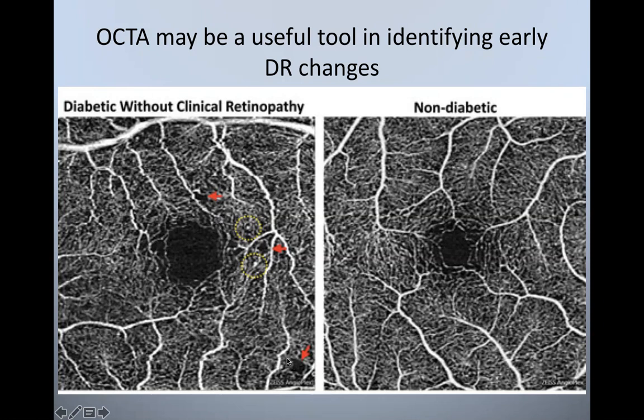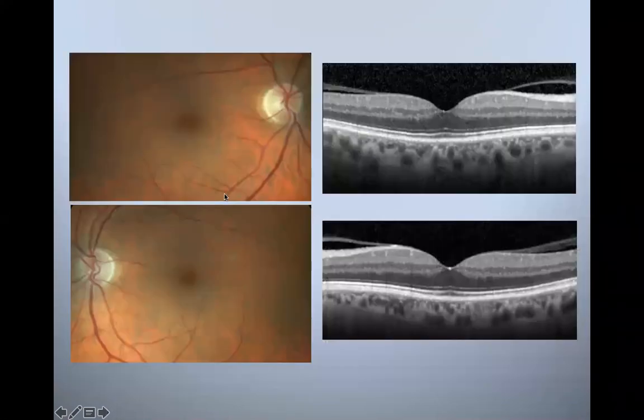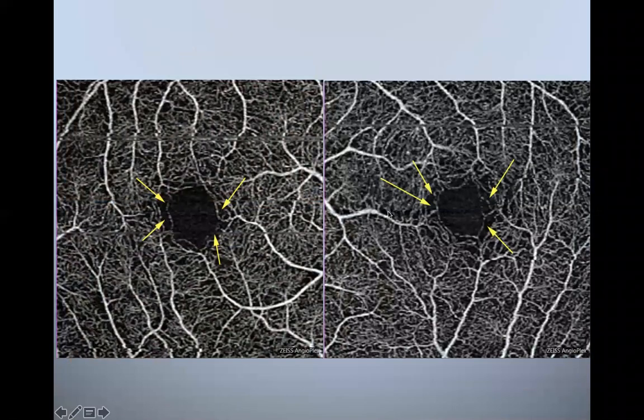And here's another area over here in the bottom right of that OCT angiogram of the diabetic. Now, the problem is, here's an example I did with a patient. So they look completely normal, not one dot blot hemorrhage, they're diabetic, their OCT looks completely normal. I do an OCT-A and I have to question, are these non-perfusion or impaired perfusion parafoveally? Obviously, there's nothing we're going to be able to do about it, but is that what's going on here? Now, keep in mind, I said earlier, this is an important thing to remember. This is a snapshot in time, is all it is.